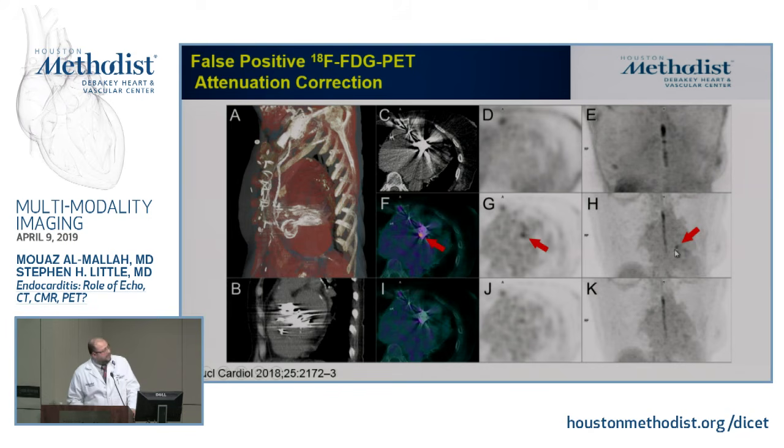So here, I don't know if it's projecting well, you see that there is something in there, and this is suggestive of an uptake with FDG. The problem with this is all this metal artifact that we're getting in these patients with ICD and others. When you see something like this, you have to confirm it with the non-attenuation correction and try also to use other software that limits these artifacts. And just by processing, you don't see it again, and this is purely an artifact. So there are a lot of artifacts that you have to work around.